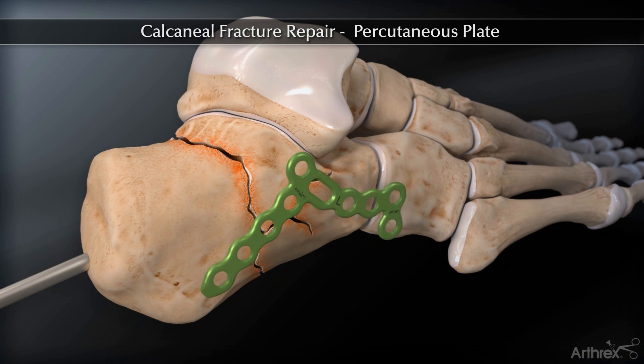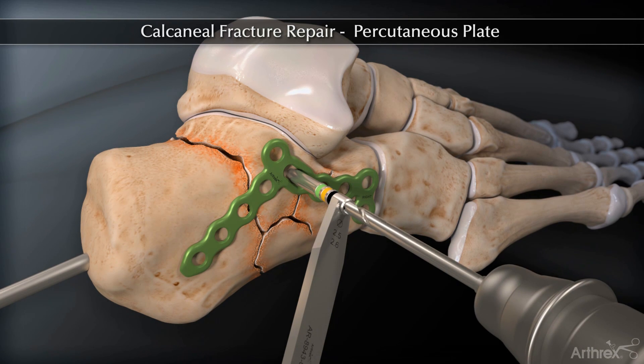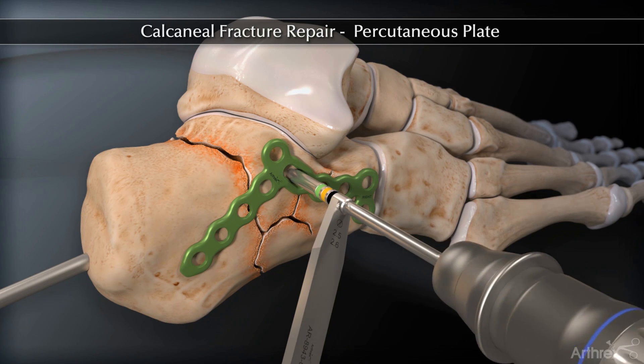Select and insert the appropriate percutaneous calcaneal fracture plate. Attach a BB-TAC or use a 2.5 mm drill and drill through the oblong hole in the plate to secure the plate to the calcaneus.